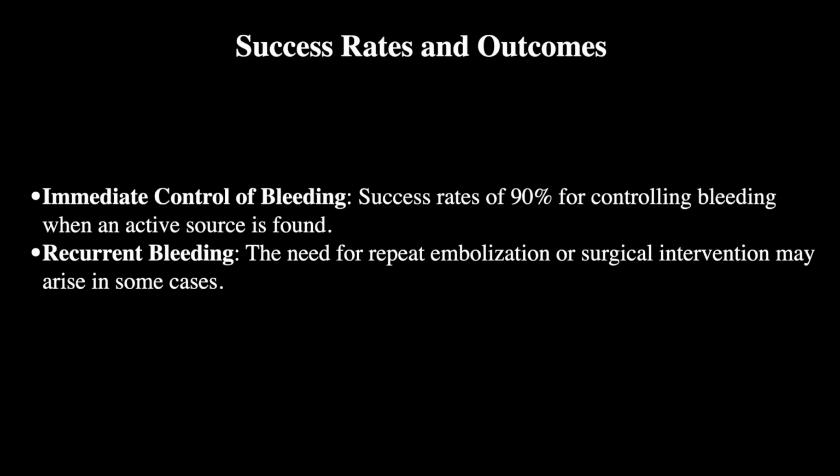The success rate is usually good; we have an immediate control of the bleeding and the success rate is 90%. However, there are chances of rebleed. In that case, a repeat embolization might be needed or maybe a surgical intervention might be needed in some cases.